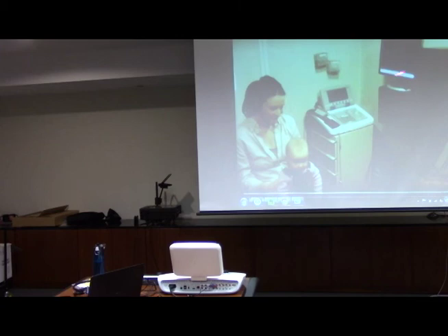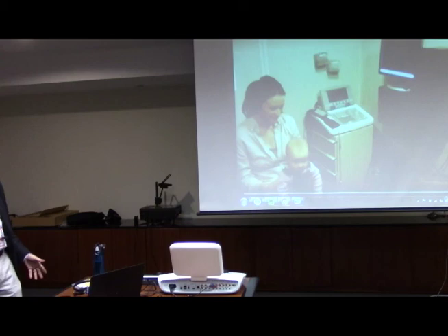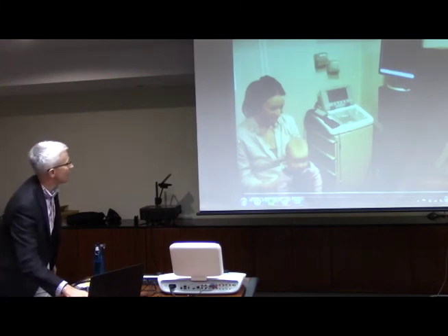Over here, you'll notice there's a video monitor, and that's going to be the video VRA. Over here, there's a toy next to it, and then down below is the speaker. It's not the clearest, but you'll get the point of what's happening here in just a second.